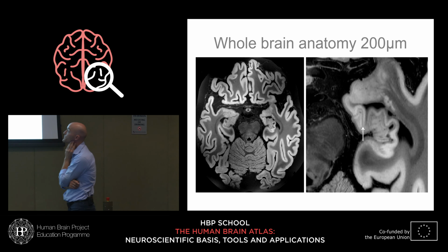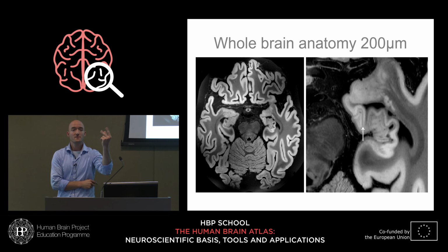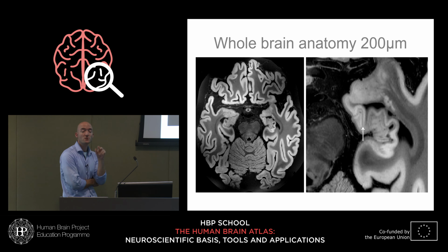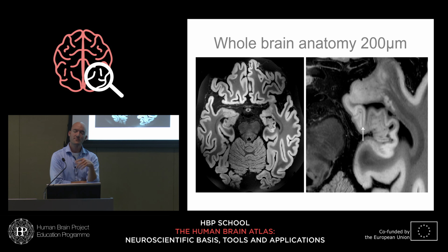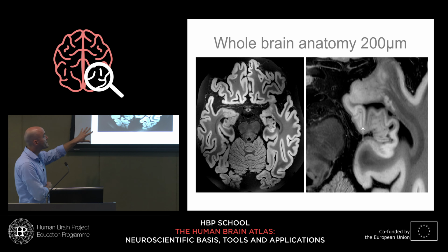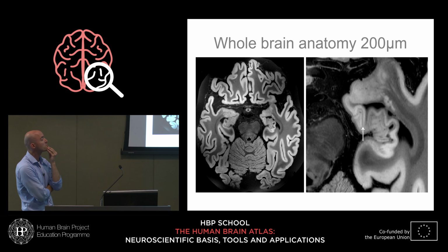And the thing you see is that there's very, very nice white-gray matter contrast, even though the contrast is reversed. White matter is very dark here, and gray matter is quite light here. That is actually one of the things that happens ex vivo when you fix a brain, and all of these brains are entirely formalin fixed, as also, by the way, in most of the Jülich pipelines, except for the PLI pipeline, I believe. All of these brains are fixed, and what happens is that some contrasts reverse. This is a T2 star contrast. A lot of what I'll show you is a T2 star contrast.